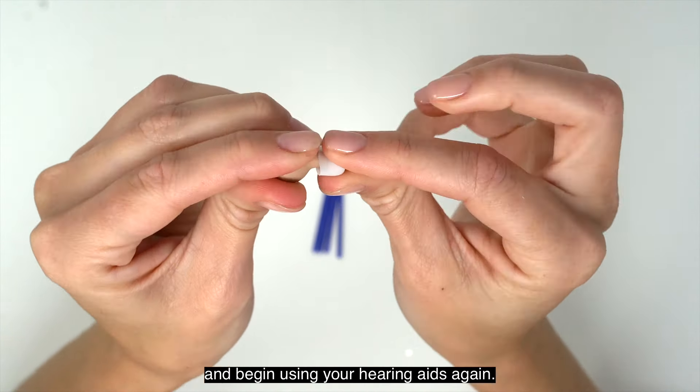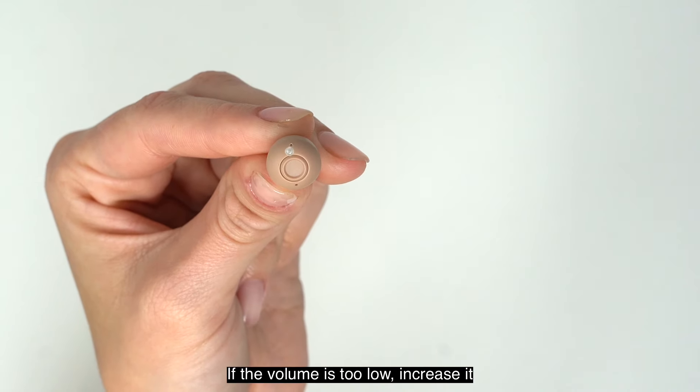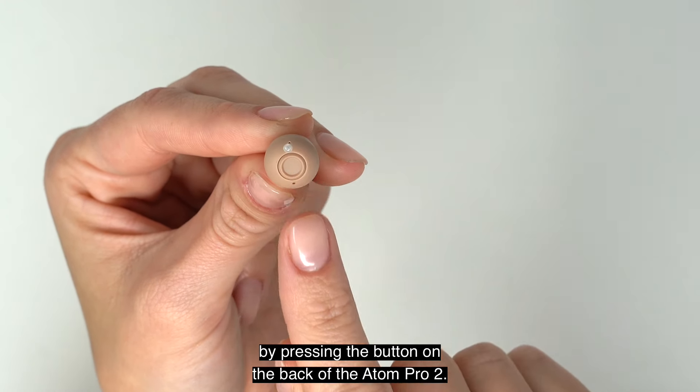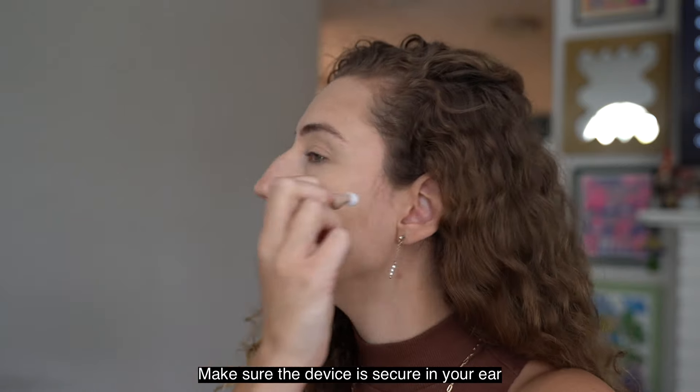Inside the box, you'll find everything you need to start hearing better. Your Atom Pro 2 comes with different sized ear domes, a cleaning brush, wax guard replacement tools, USB charging cable and wall charger, charging case, and the Atom Pro 2s. For any additional resources, visit our support website at audienhearing.com/support.